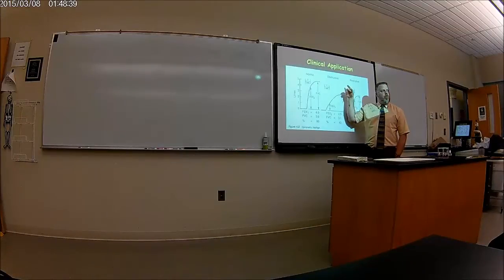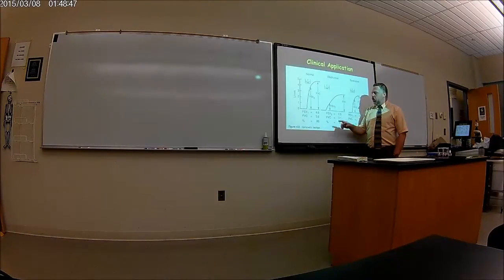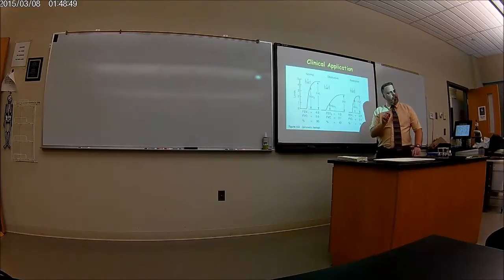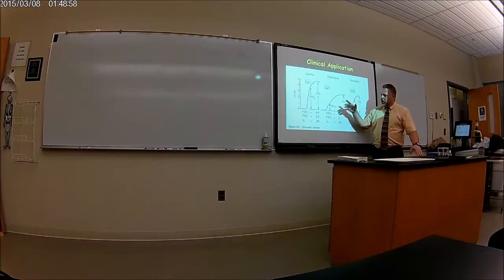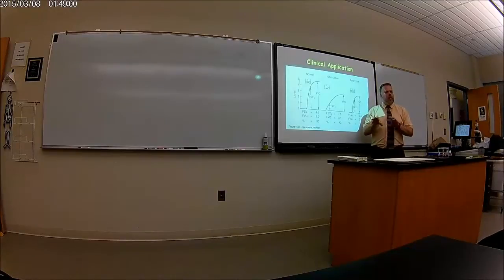They can't blow off all the air. So here's their FVC, the total amount of air. In this case, it's about 3. Then they want to calculate how much came out in the first second. Not much. Maybe 1 liter. If I give you this on a practical exam, I'm going to give you numbers that you can work with without a calculator. Okay?